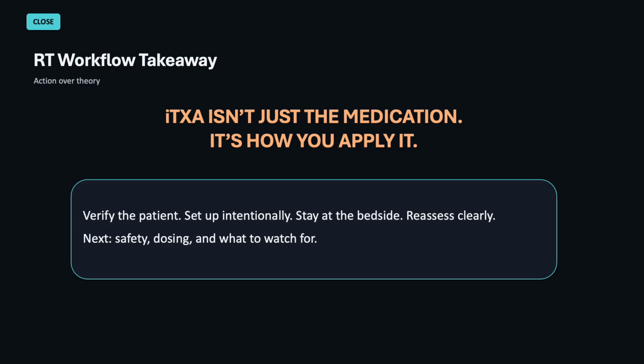Inhaled TXA isn't just the medication, it's how you apply it in the moment that matters. Verify the patient, set up intentionally, stay at the bedside, reassess clearly, and understand this: right patient, right setup, right flow. That's what determines whether this therapy actually works. That's your workflow, that's your rhythm.